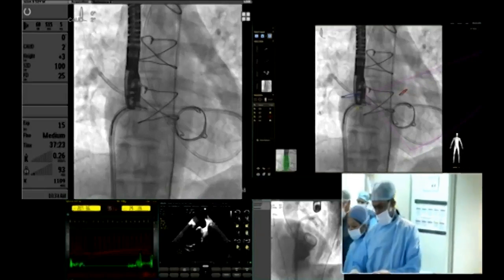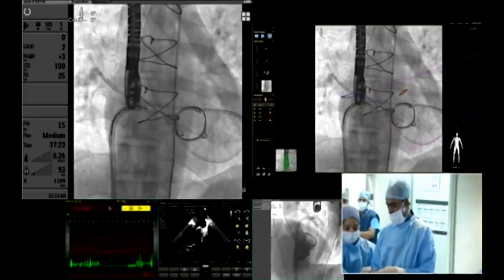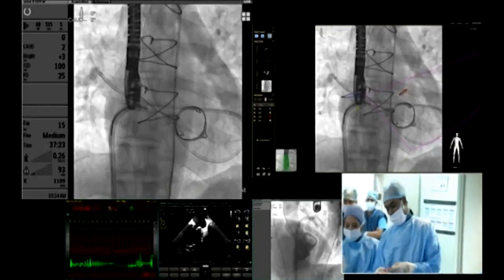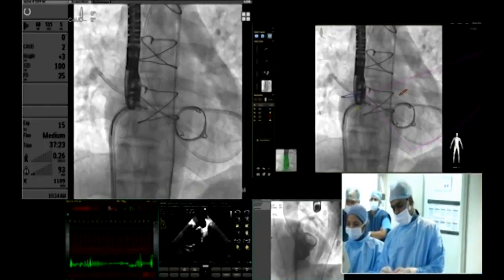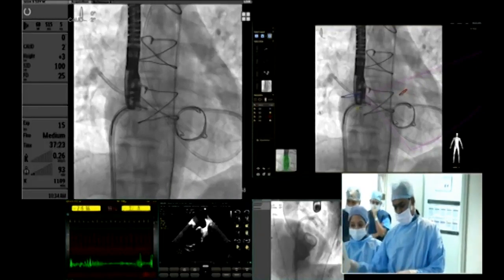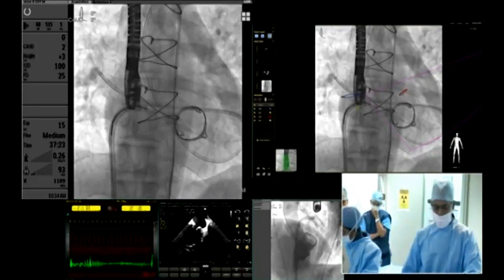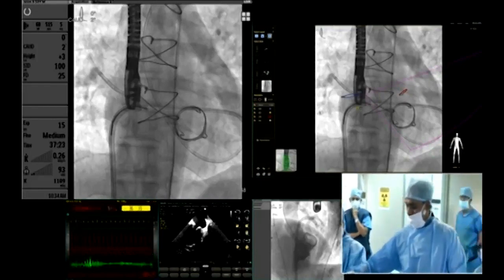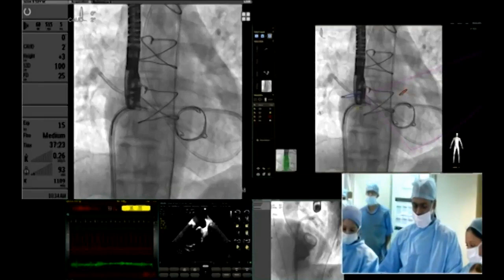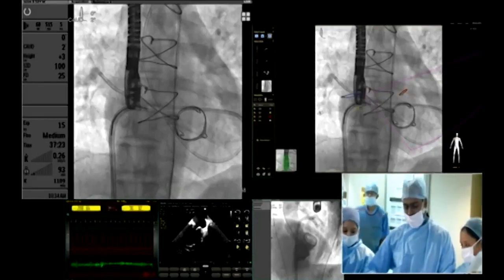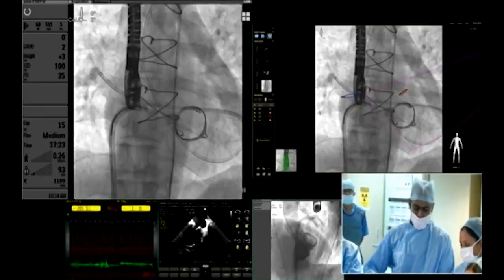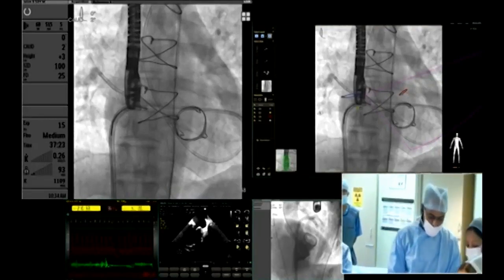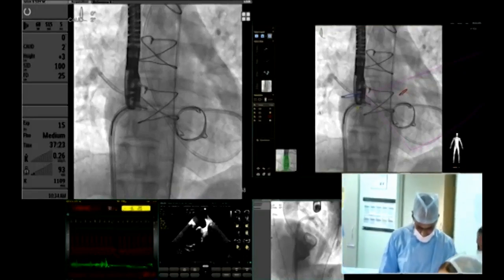Sometimes when we are struggling we can enlarge the defect also — subject to whether 12 AVP2 is compatible with an 8 French guiding catheter. Manipulations may look like they are enlarging the defect, but there is a lot of fibrosis in that area and subsequent entries become easier.